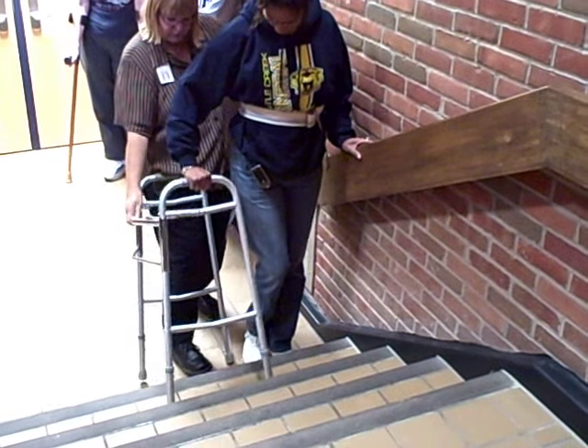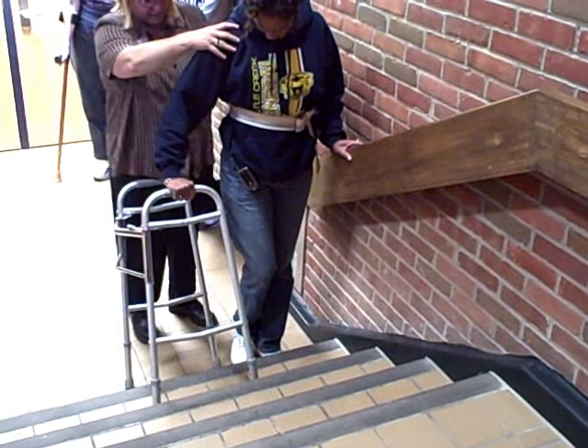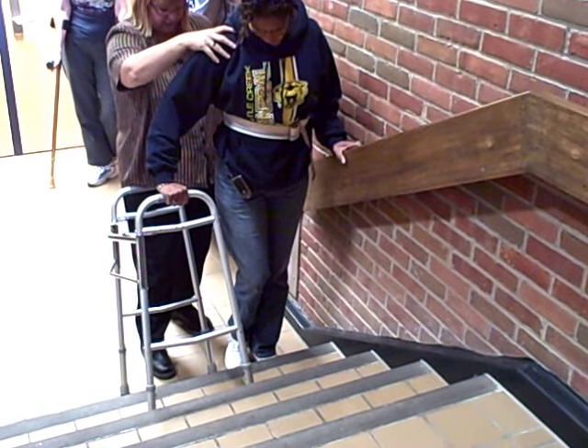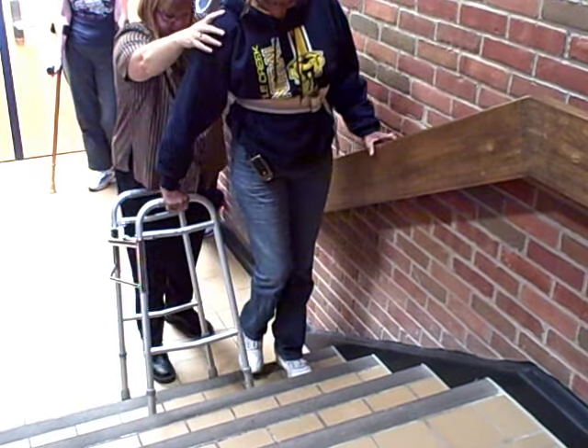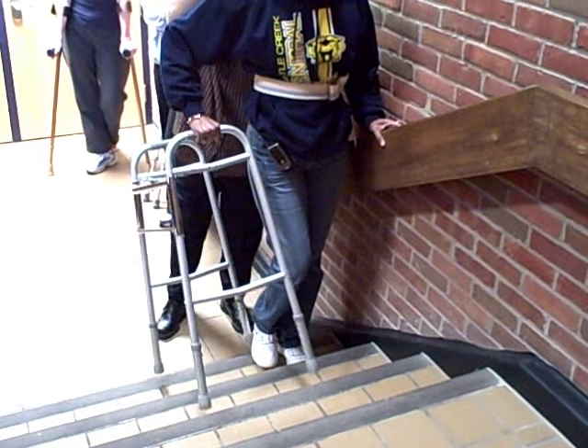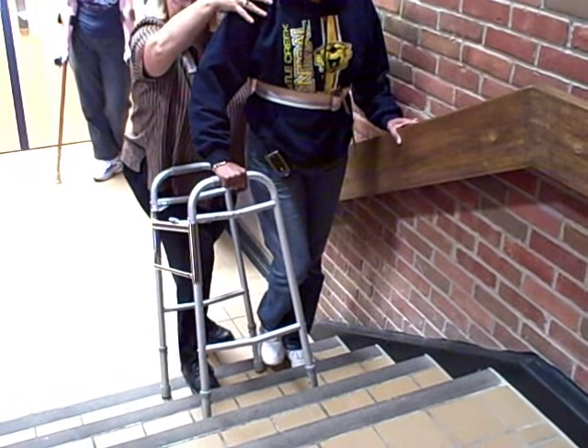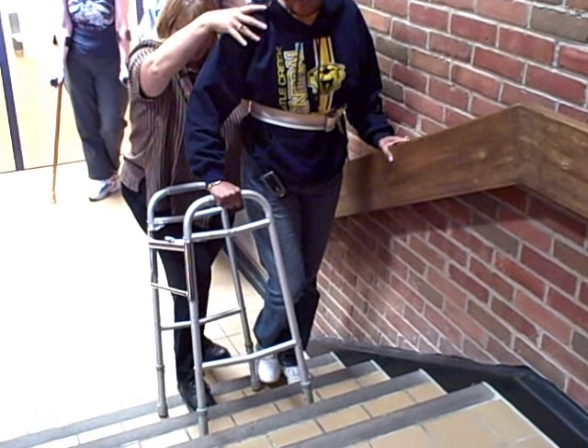We can move this up a little closer. Then you're going to go ahead and use your arms and get yourself up so that your left foot is on the stair, and then bring the walker up. Now I can get out of the way while she moves the walker, but once she has it set, then I want to be up close again. Go ahead and step up.